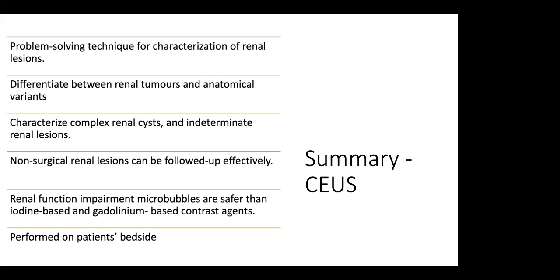And this has to be complemented, as Nazim also asked in one question about the color Doppler, with the grayscale findings, the Doppler findings, and the contrast-enhanced findings. It is not an isolated test. Plus, of course, we have the cross-sectional imaging that we need to see, and everything that we are suspecting should be reproducible, which makes it definitive to be called abnormal.